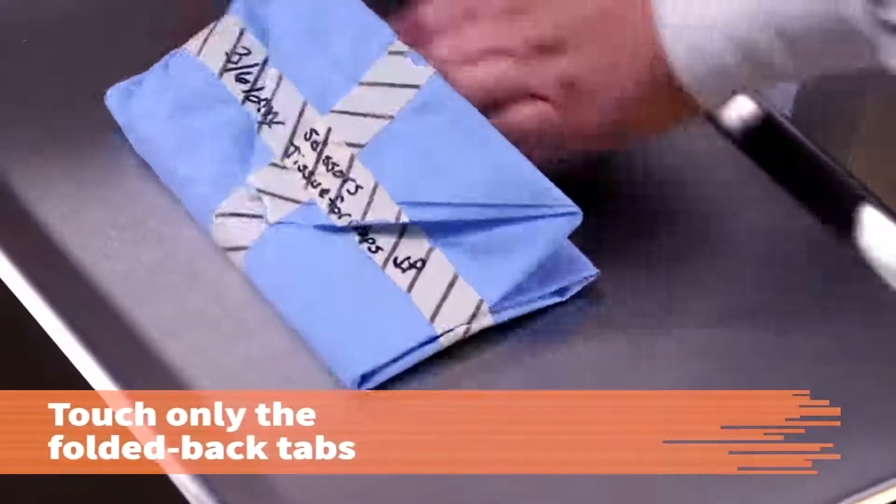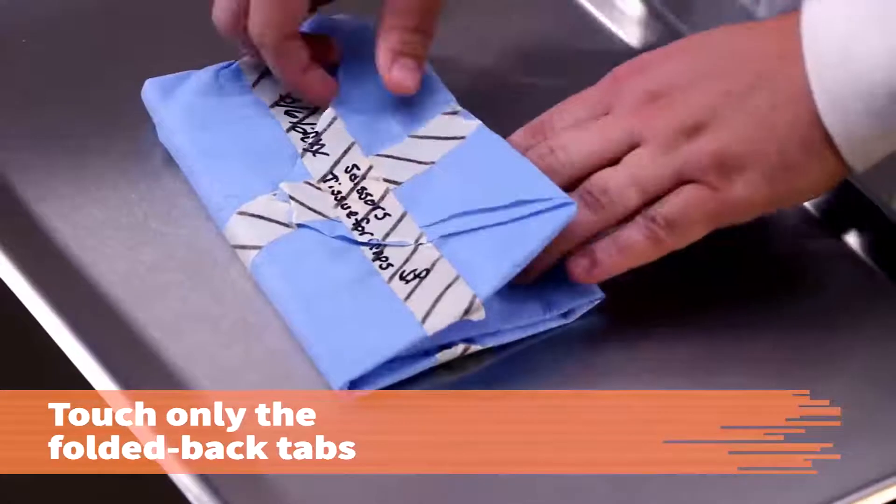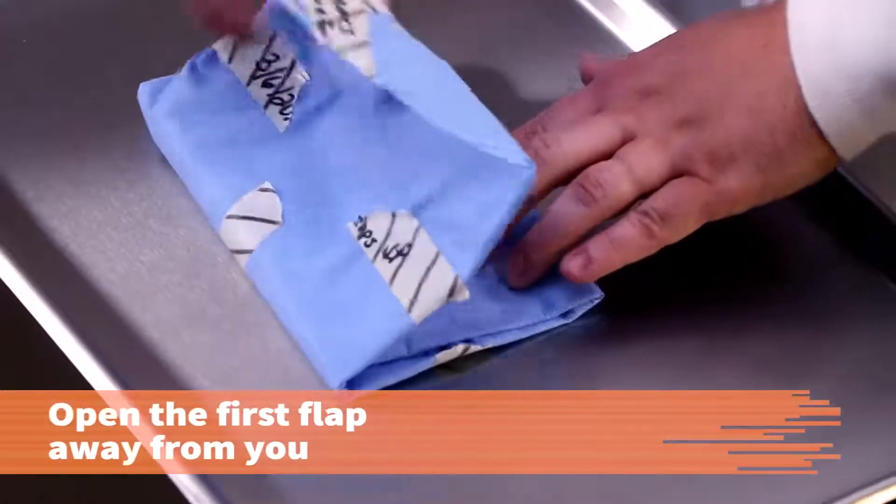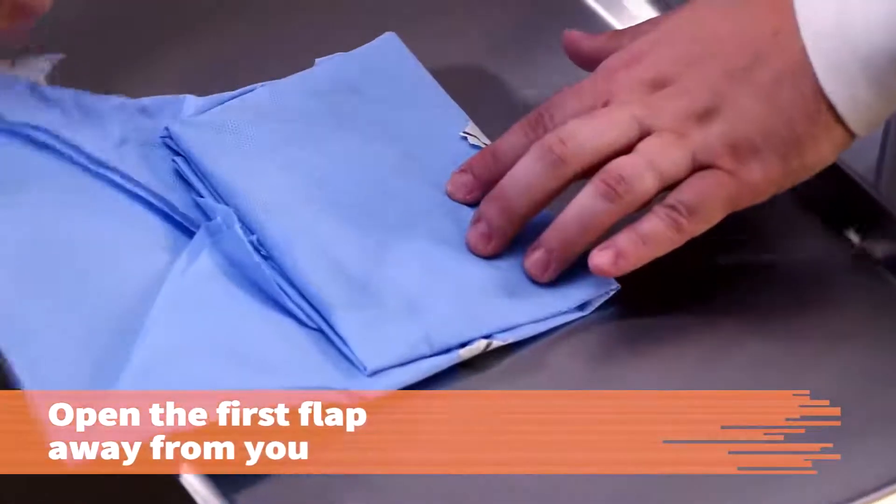Carefully lift each flap by touching only the folded back tabs, without touching or crossing over the inner surface of the pack or its contents. Next, open the first flap away from your body.